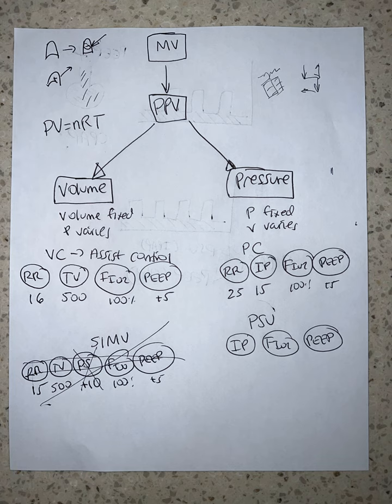Here, there's a backup rate in case the patient wants to stop breathing. Here, there's apnea ventilation, but technically, this is totally spontaneous. There's no rate. The ventilator is not giving any breath. This is all patient initiated.